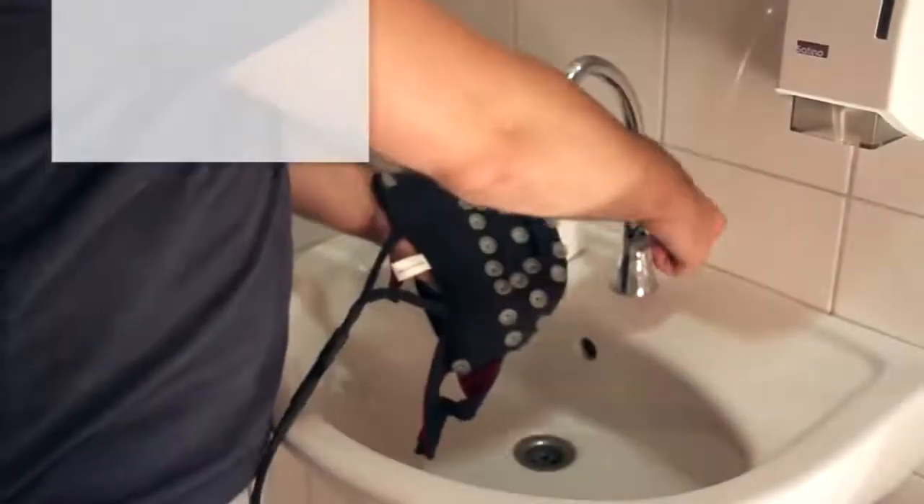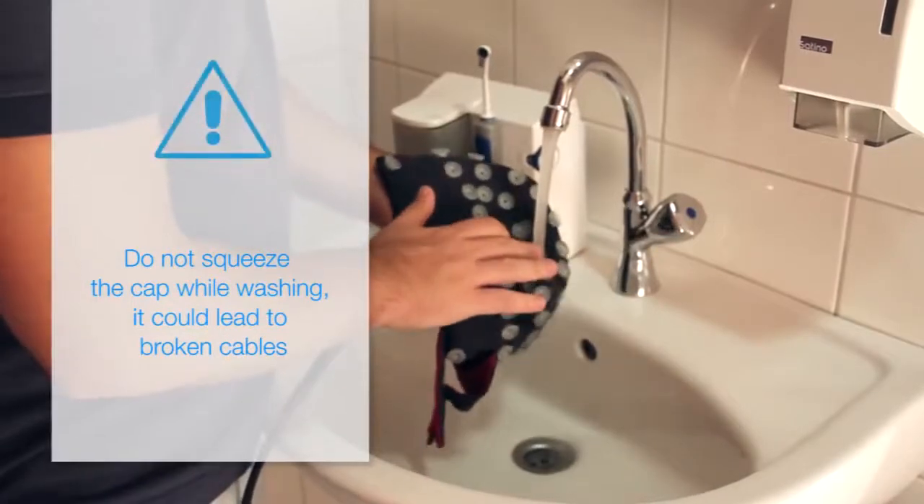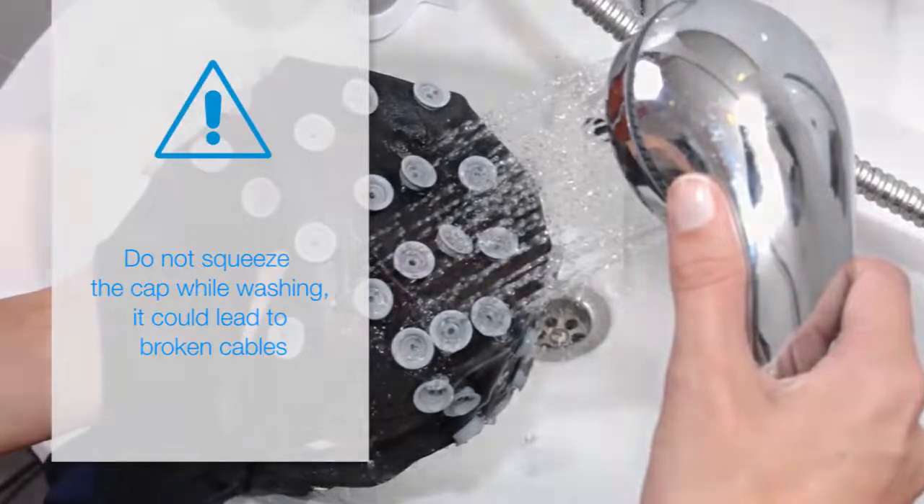To keep waveguard caps in good condition and extend their lifespan, it is important to clean caps after each use. Wash the cap immediately after each recording. You can do this at a wash basin or sink. Using a showerhead faucet attachment makes washing the cap fast and easy.